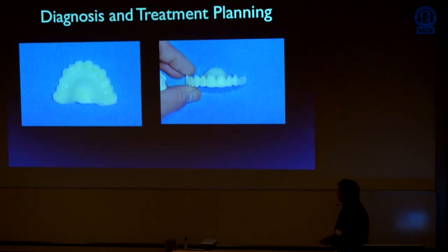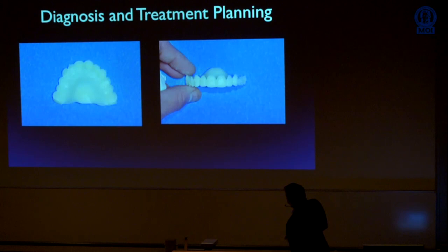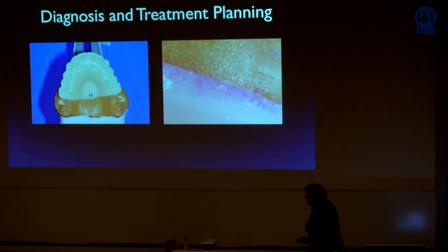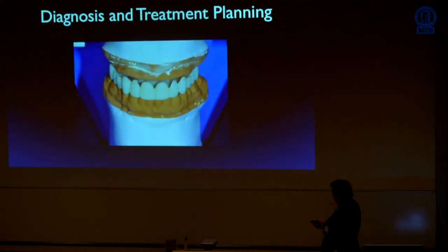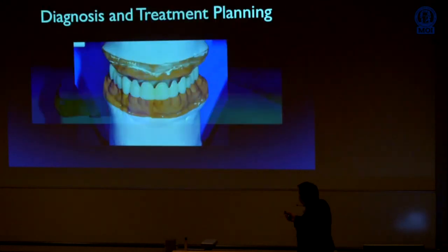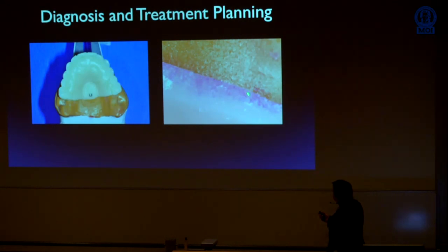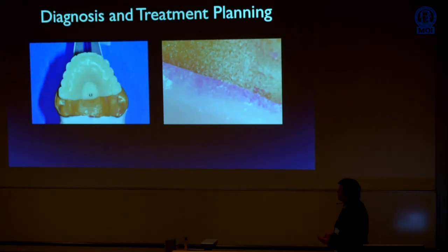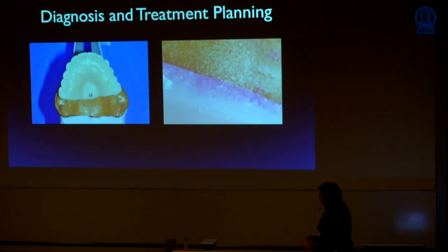So there's our milled PMMA, not a great photograph, with the exaggerated palatal contour. This is it seated on that model where we had all of the upper teeth taken away. And this is how well adapted it is. The pink is a fit checker that I use to see how well it fits. So I keep adjusting a little bit so that I get it to fit perfectly. Because I was very confident in that initial scan, and because stuff just fits so well with the Trios scans, I go into these thinking that this is going to fit quite well.